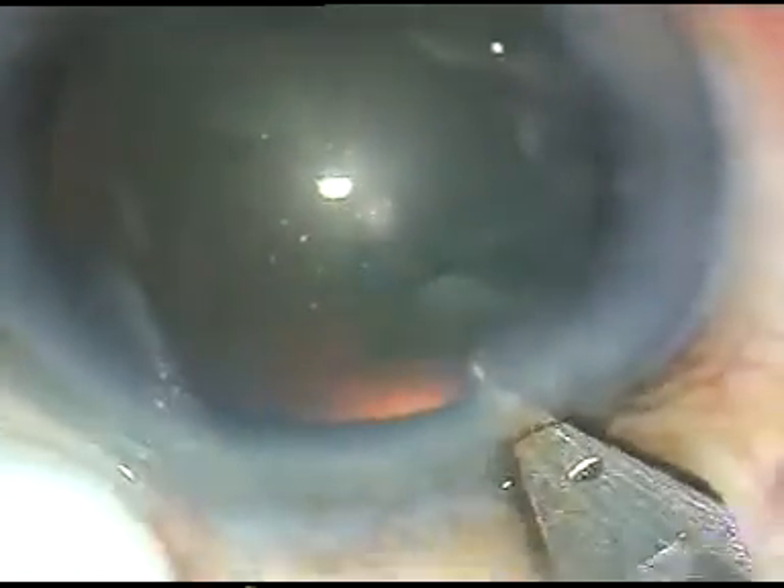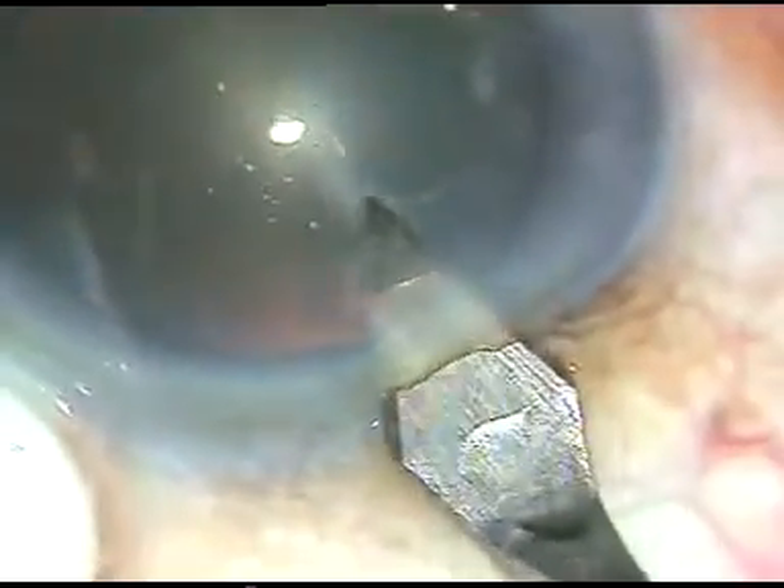Dear colleagues, in this video, I am going to demonstrate my lens tilt technique for soft cataracts.